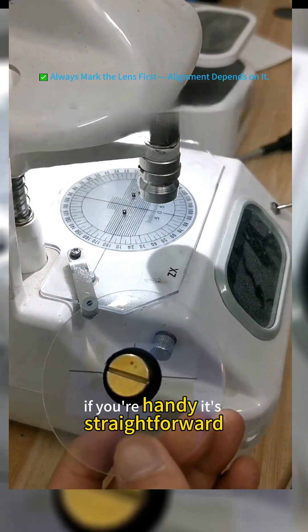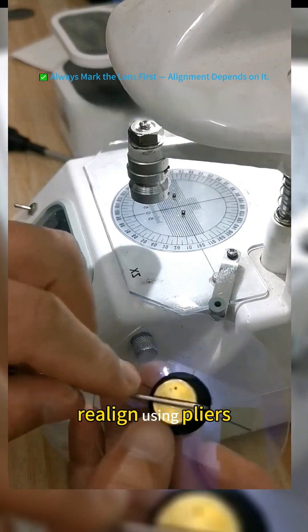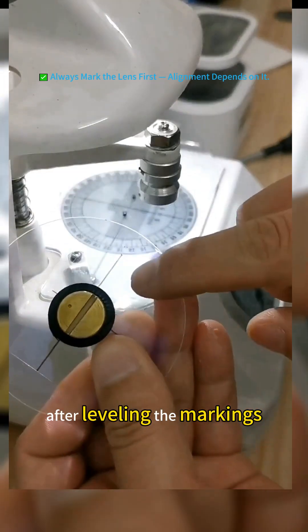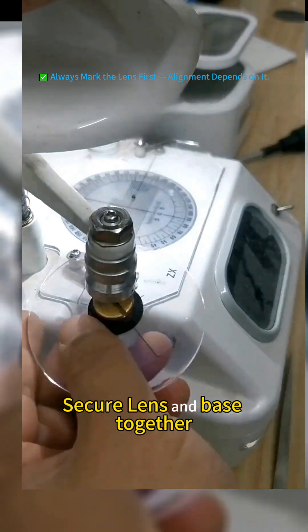If you're handy, it's straightforward. Realign using pliers. After leveling the markings, secure lens and base together.